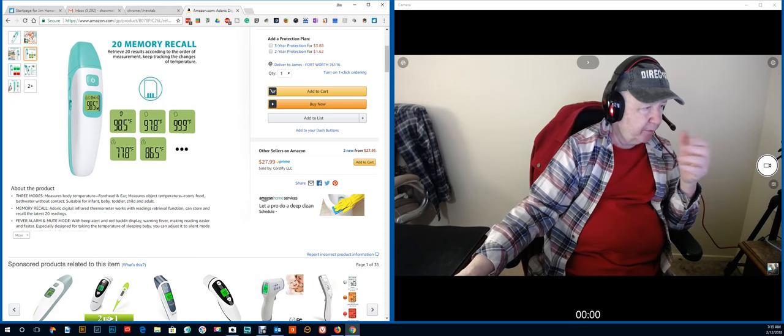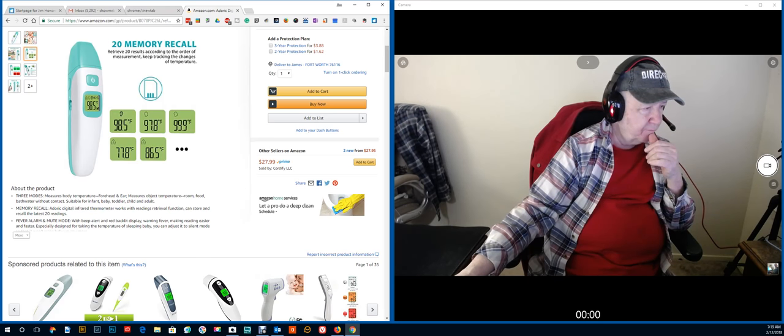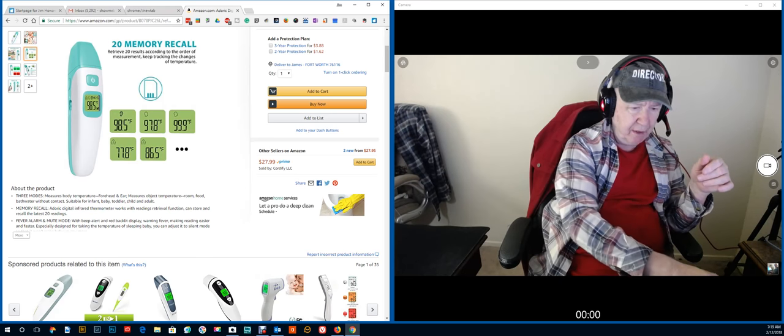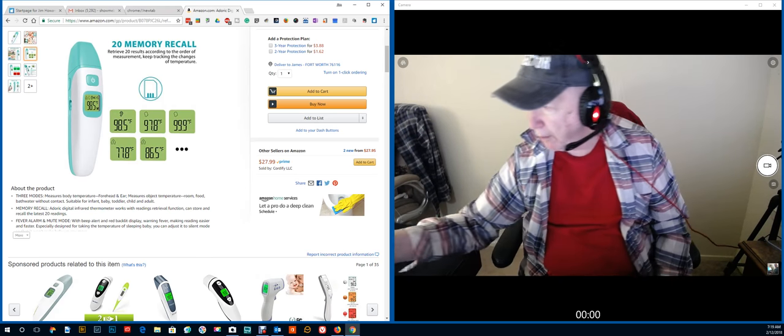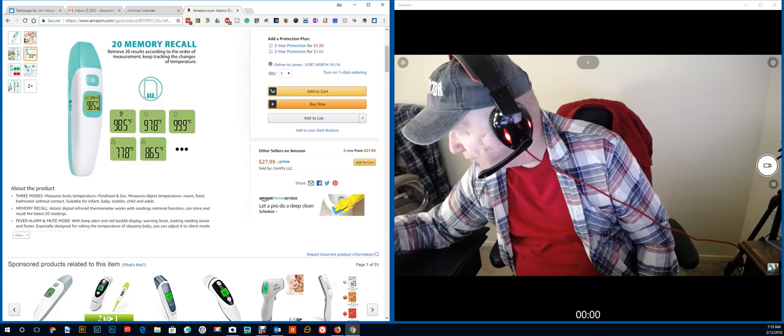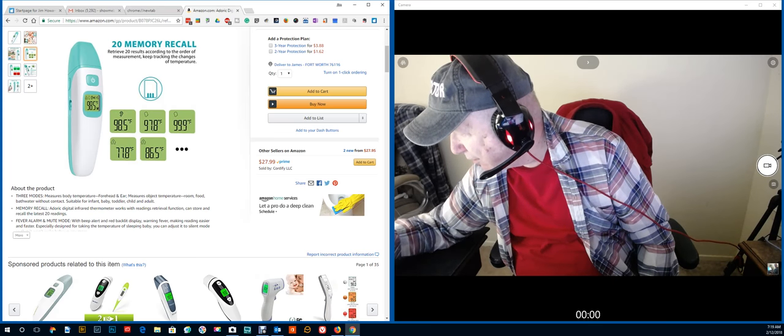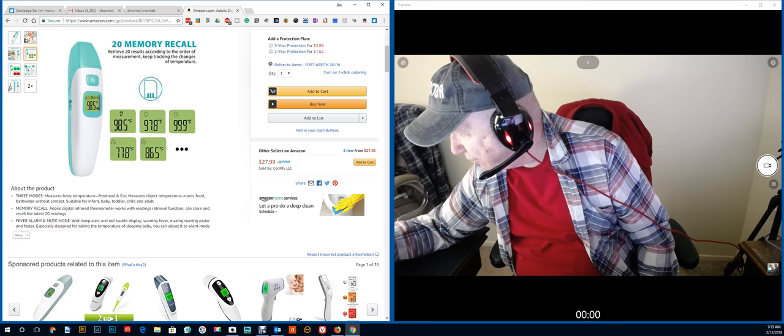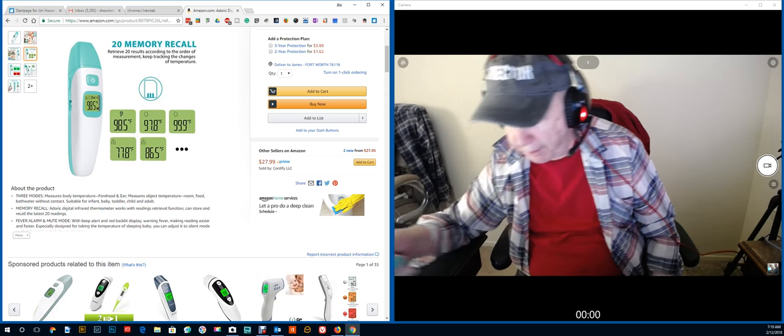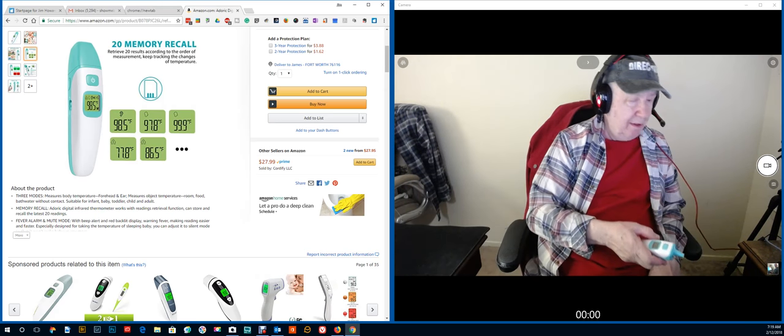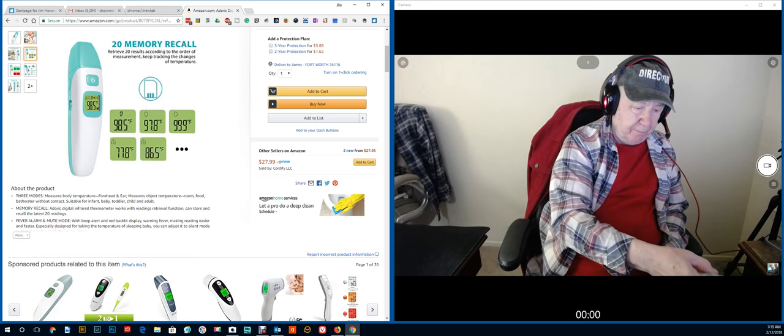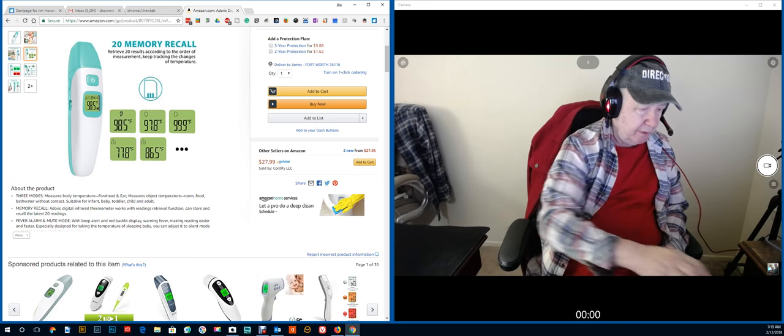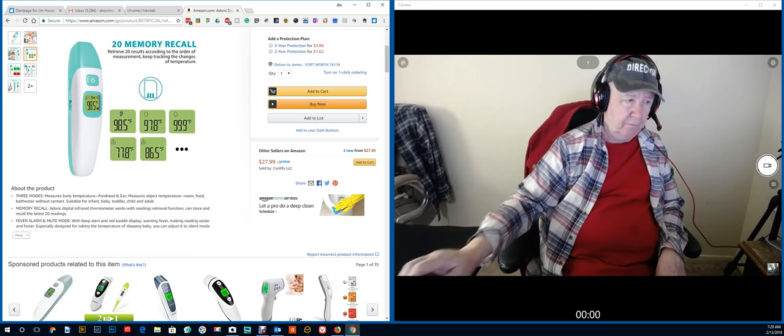Memory recall, fever alarm, and mute mode. I wonder if I have the mute mode. I know my hearing is bad. Yeah, let's see. Off. No, I have it on. I don't know if you can hear it. Ha ha ha. Hear it beep or not. I can't with my hearing. That's the range that's.